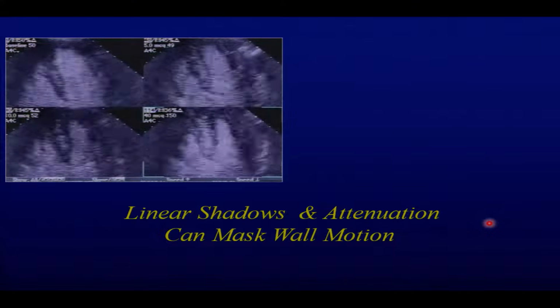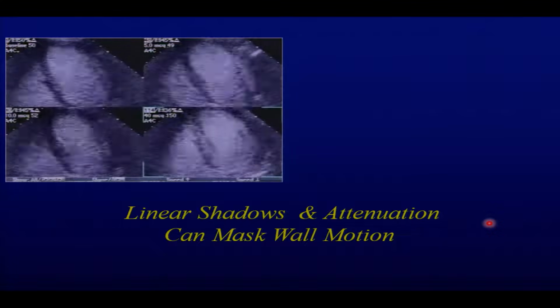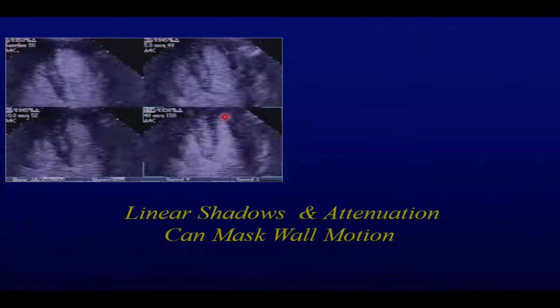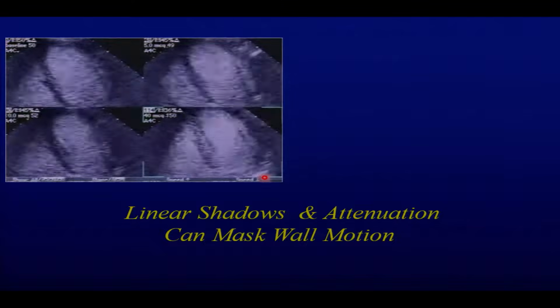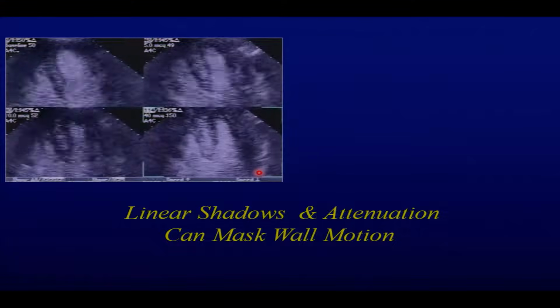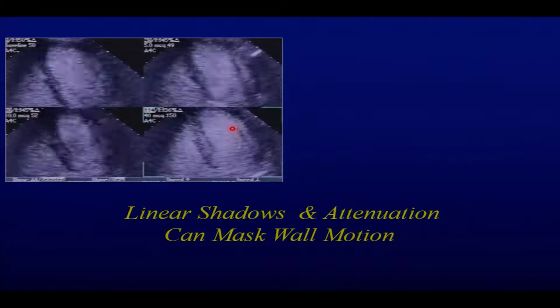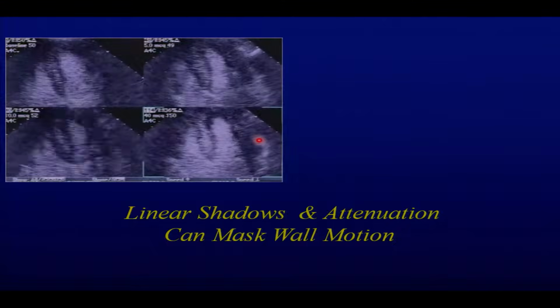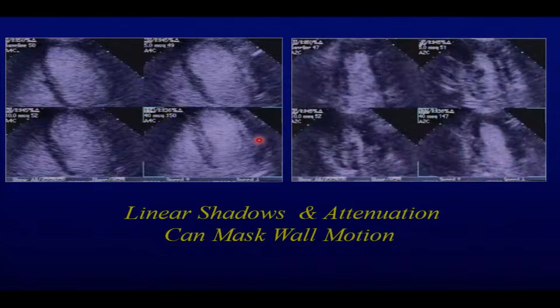And part of the reason, if you have beautiful echocardiograms, not to use contrast is what you see here. I always teach that if you have a linear configuration of a structure in the left ventricle, it's either a tendon or an artifact whenever you see contrast, right? And notice this shadowing of contrast from a structure here. The endocardium is way down here, and you gotta be very careful about your interpretation. Your eye will be fooled, okay?